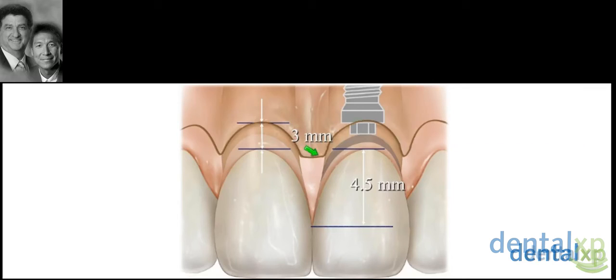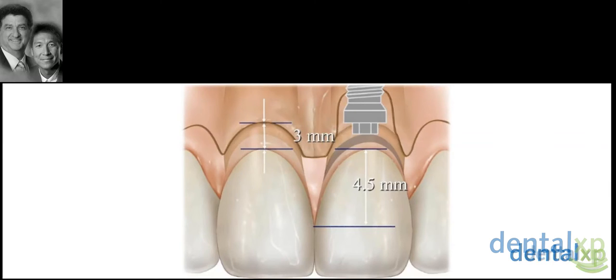We then get a biologic width formation, and you start to see we have bone loss down to about the first thread on this implant. If we use a platform switch implant, it might only be like Prevail or Astra or LifeCore, or Dentsply. What we see is it might only be 0.5 millimeter down. But a normal one, typical, like the original Branemark implant, was about 1.5 millimeters. So look how far away the bone is on the implant. It's way up there where the arrow is.